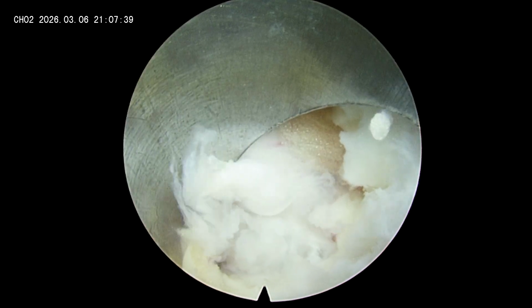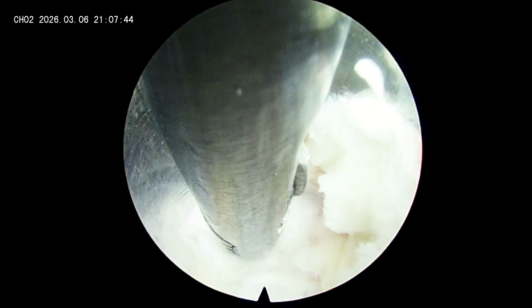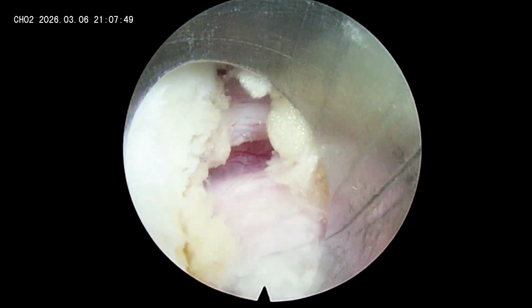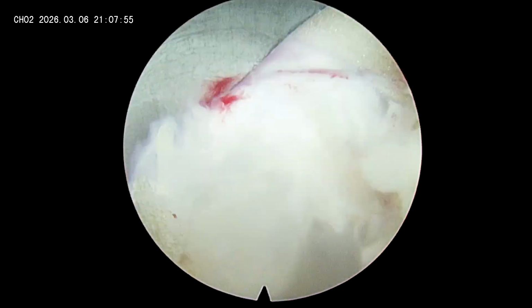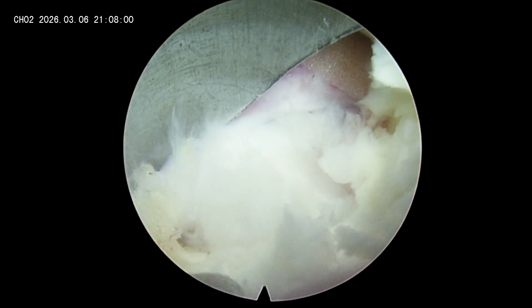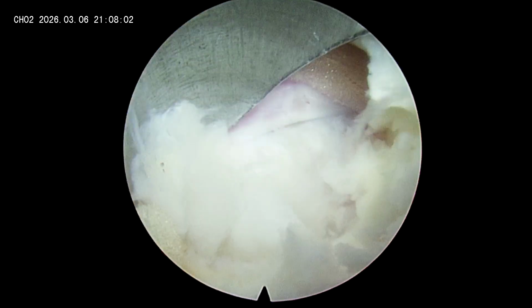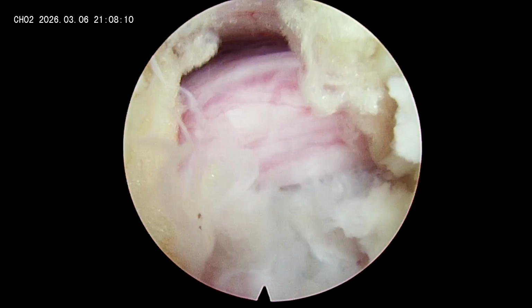Now I can do my disc work here. You have three things to do. Number one, you have to remove the sequestrated fragment. Now you can see there is a huge fragment which is coming out. At the same time, you have to handle the annular hump as well. And the third part is removing the free fragment from the disc space. So here I am going inside the disc and removing the free fragment from the disc space.